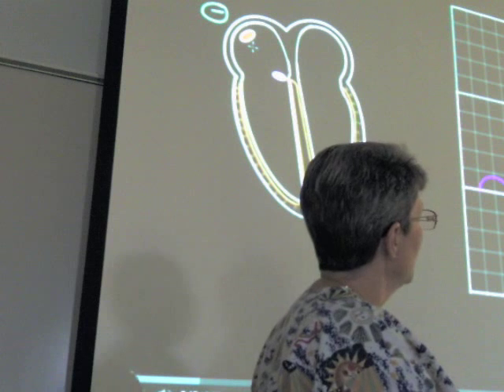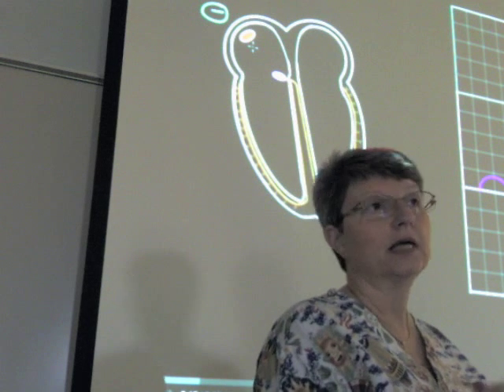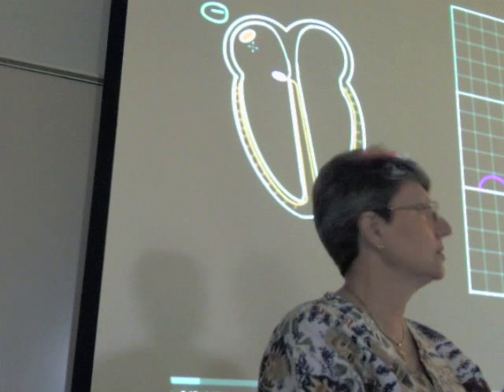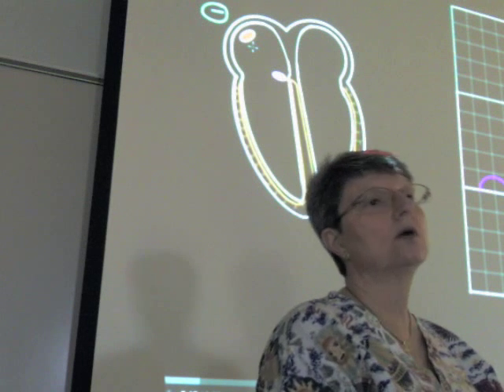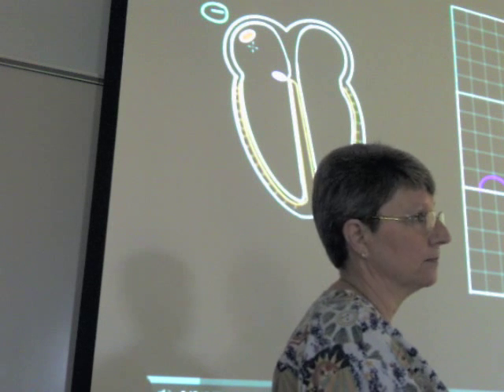So that's why it's such a large part of the complex, because that's the biggest event, or biggest part of the heartbeat, when the ventricles contract.